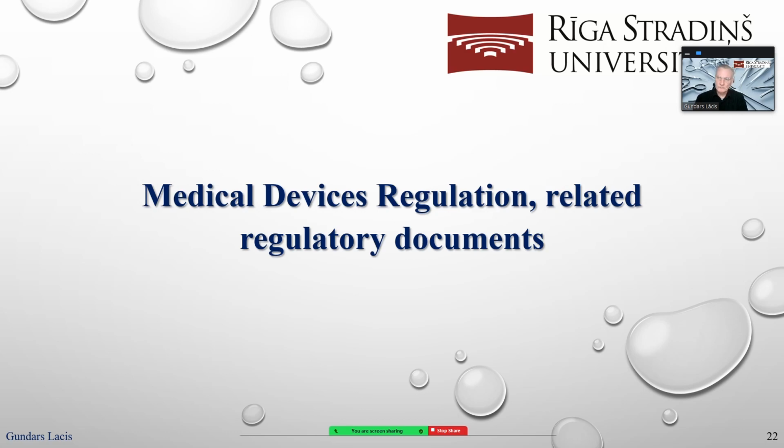Actually, now starting from 2021, in the European Union, we have the medical device regulation. Before this, we had the medical device directive. The difference is that the medical device regulation is stronger than the medical device directive. But it's only for the European Union. All over the world, of course, there are different regulations about medical devices, but now I'll speak about MDR.